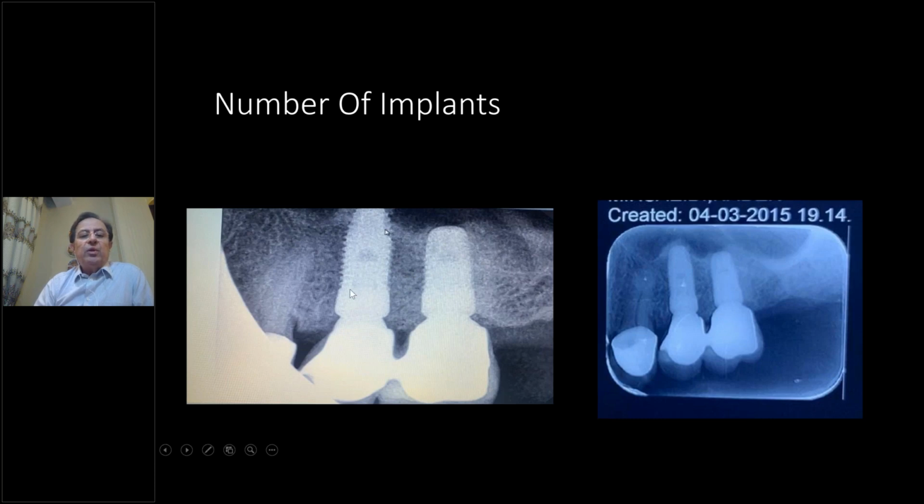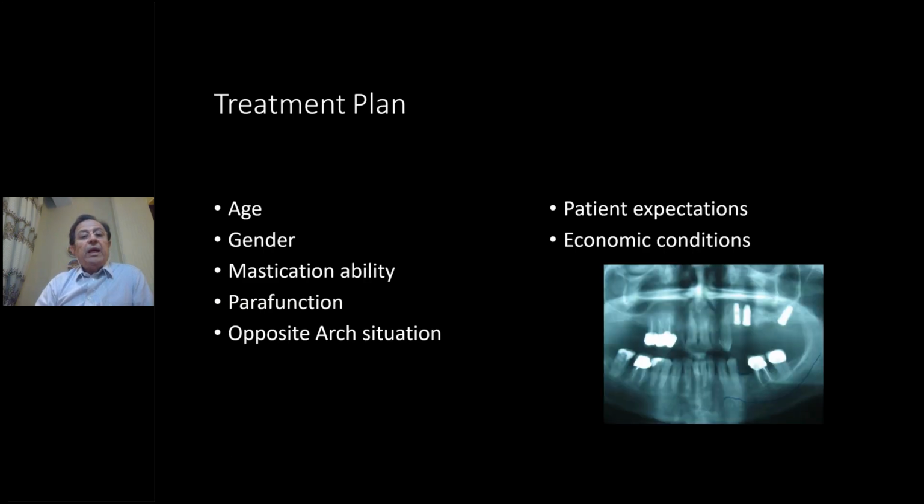But if we have 5 millimeters under the sinus for one single implant, the chance of perforation will increase. Another factor we must consider is age. For an elderly patient, we can consider a shorter implant, and if we have, for example, 5 millimeters or less, 4 millimeters, we can go to closed sinus lift and put in an 8 millimeter implant.